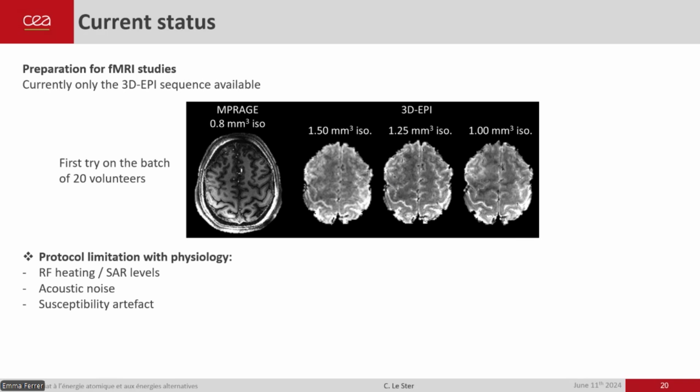The SAR levels will be, of course, a limitation because of the RF heating. Also, the acoustic noise of the sequence will have to be measured, so as not to be too loud. And the susceptibility artifacts that increase with the field also will be a limitation.